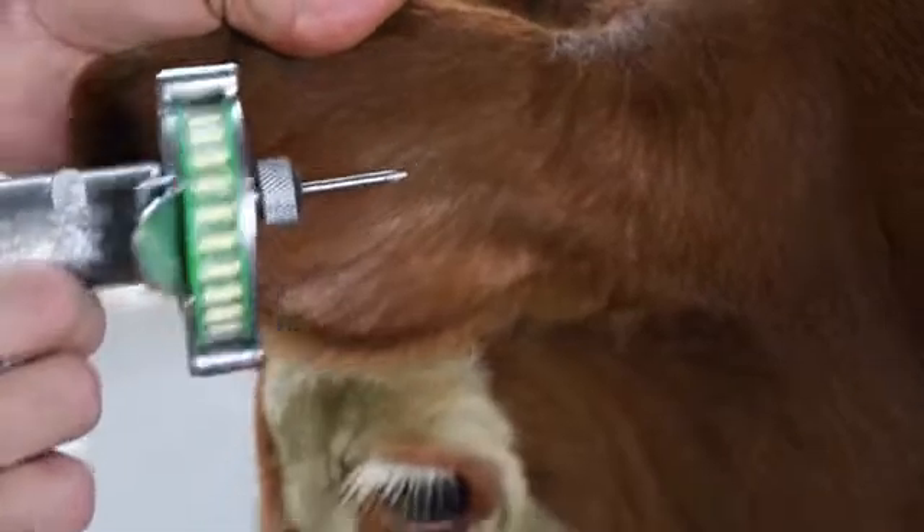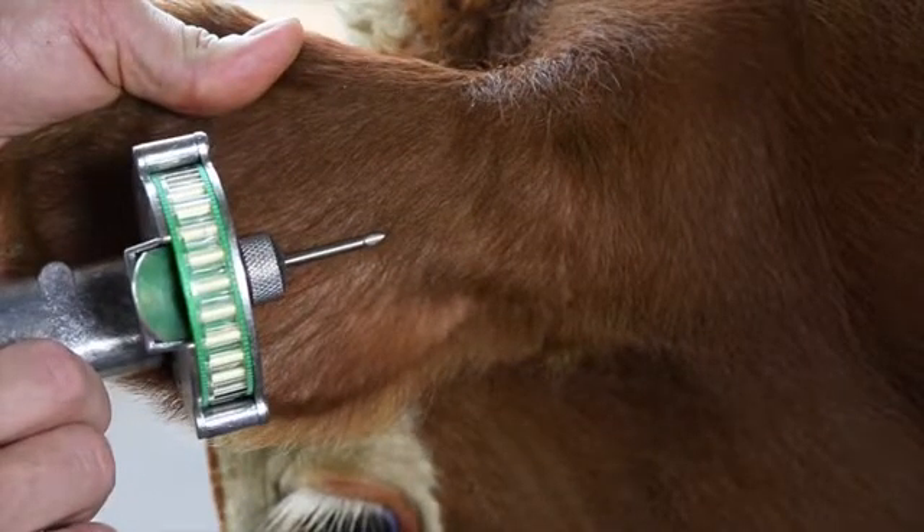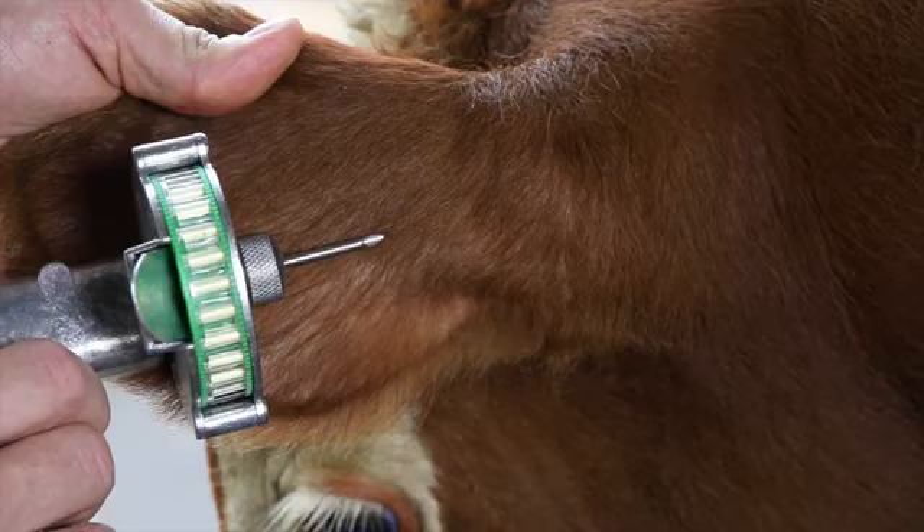Step 5. The location for the insertion of the needle should be at a point toward the tip of the ear, at least a needle length away from the intended deposition location.